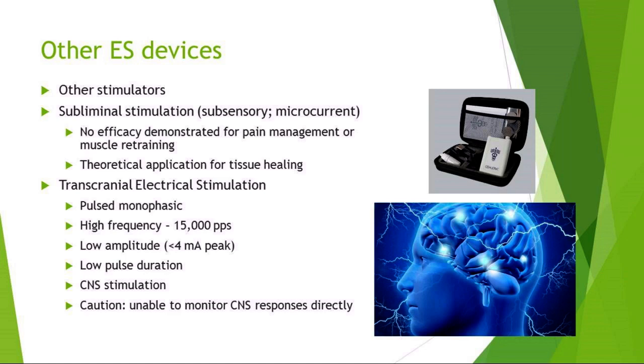There are some things that have subliminal stimulation, so they're subsensory, you can't really feel them. Microcurrent. There's no efficacy that's been demonstrated for pain management or muscle retraining for subsensory stimulation, although there's a theoretical application for tissue healing, and there is some research in using it for PTSD, depression, insomnia. I have a microcurrent device that I will bring into the lab, and you can try it out, see what you think.